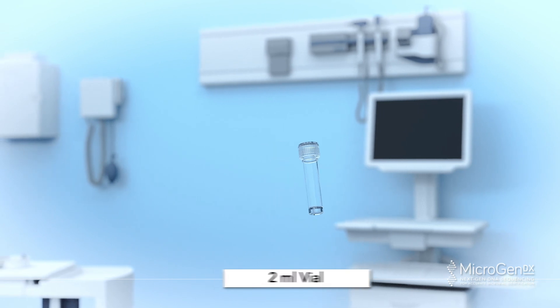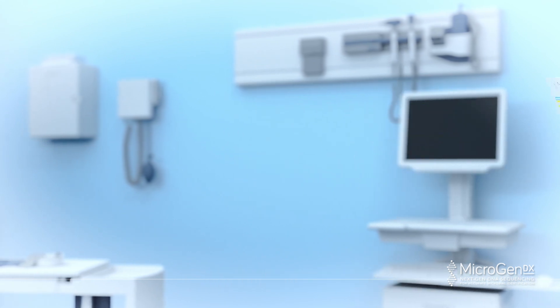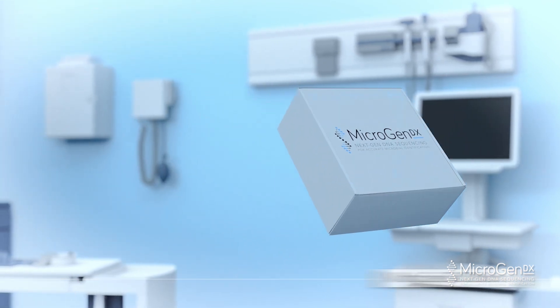MicrogenDX Collection Instructions: Wound Sample Collection Method. The MicrogenDX Collection Kit will include one 2-milliliter vial, one dry swab, a bio bag, a lab requisition form, and a MicrogenDX box.